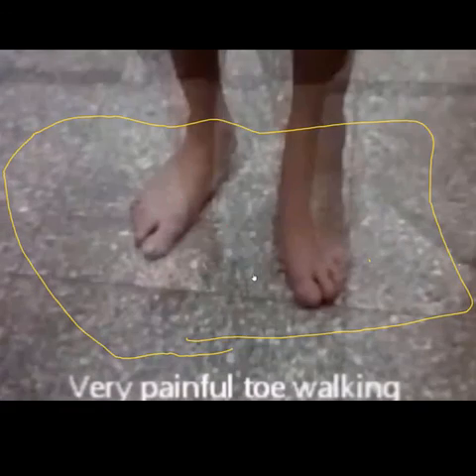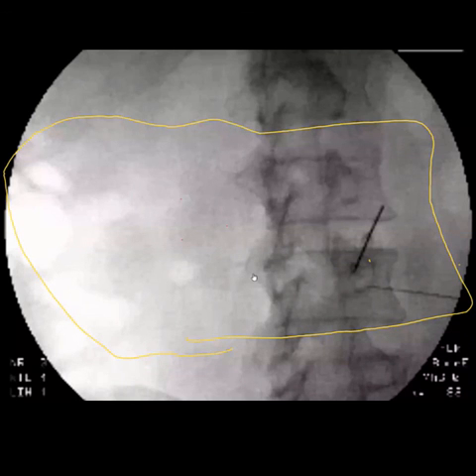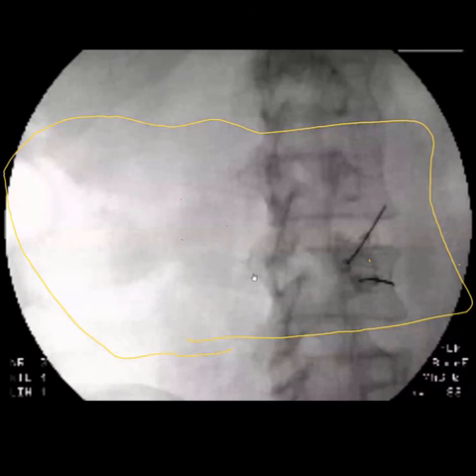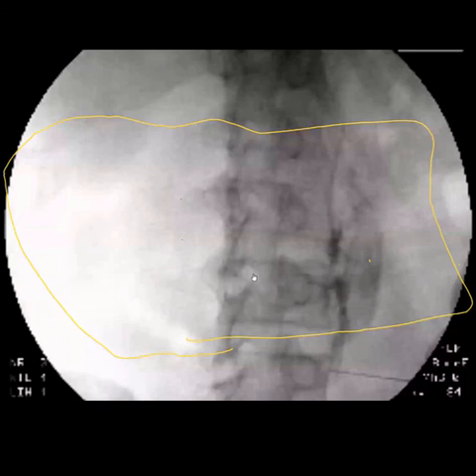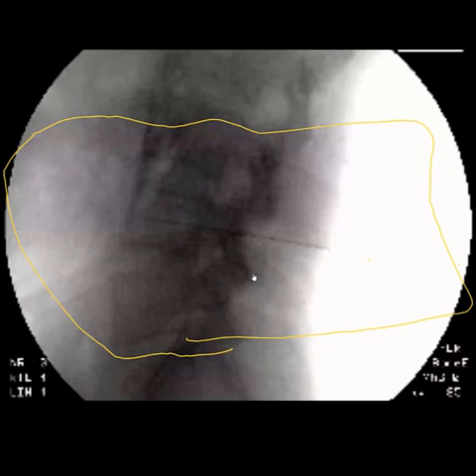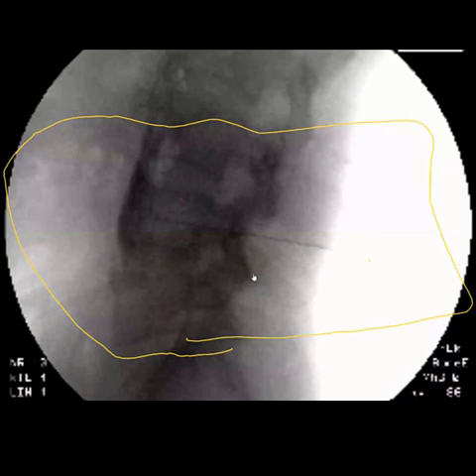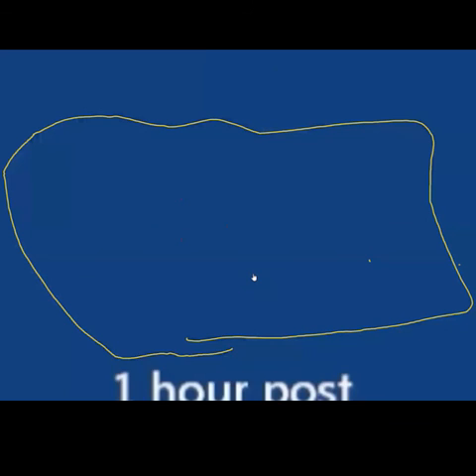And he came to us suffering from bad pain in the leg, and neurosurgery referred the case to us. And we did a lumbar sympathectomy for him in such a way that we did the diagnostic block first, with contrast at L2 and L3 and then at L4. And then we didn't do a neurolysis. We just performed a local anesthetic and steroids, and we left the patient to ambulate and to do physiotherapy. The single diagnostic block was at the same time therapeutic, and the patient had a good outcome and he was moving the leg at the end of the procedure, as you can see.